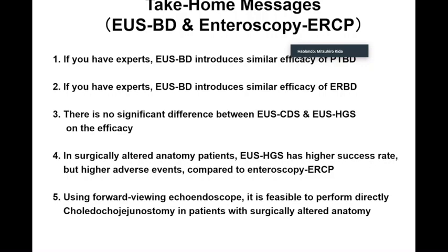For malignant lesions, for drainage, EUS-HGS, EUS-BD is much easier. But for benign lesions, we have to think about the treatment techniques, EUS-BD or enteroscopy ERCP, especially for bile duct stones and stenosis of the anastomosis. Thank you for your kind attention. This is our staff.